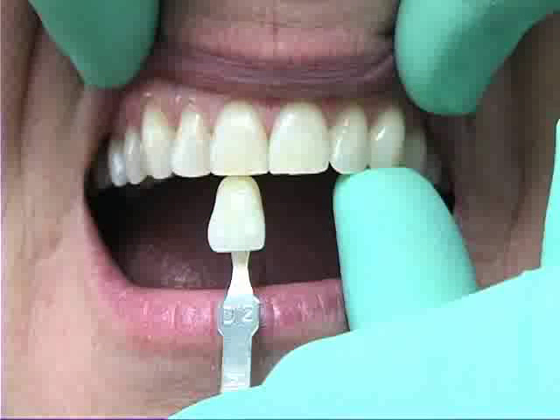Even though the selection process has now been completed, it is a prudent process to verify value, since it is generally recognized that lightness and darkness is the most important of the 3 dimensions of color, and the aspect most critical to optimizing the color match between an artificial substitute and natural tooth structure.